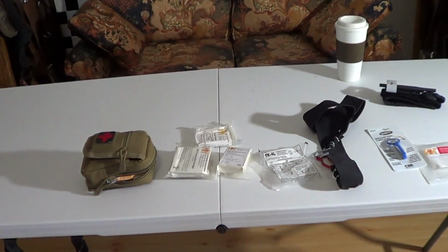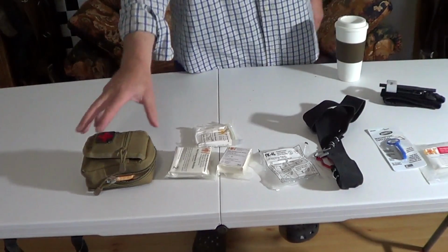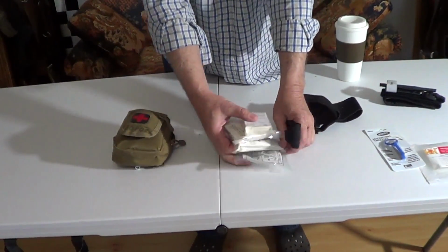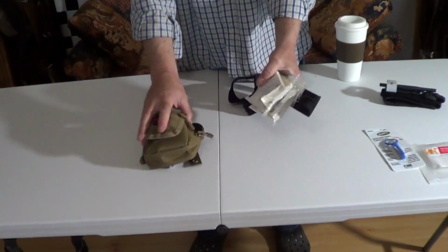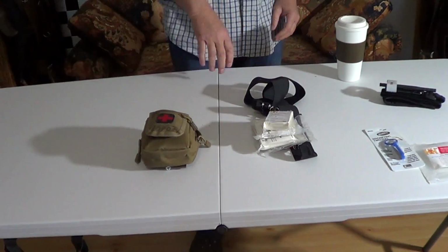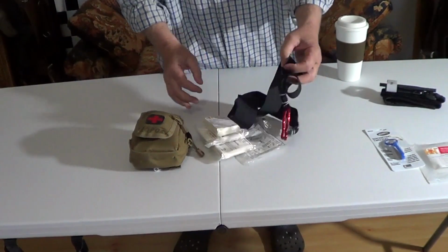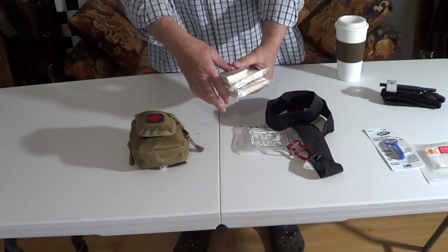Young people, I wanted to do a little follow-up on my little kit. All this was in that plastic bag, sealed, and I never really opened it up because I haven't had this out in the field yet. It was just sitting there, so I figured I don't want to be digging or having to cut if I needed a tourniquet. So I went ahead and took it out of the plastic, and I'm kind of glad I did.